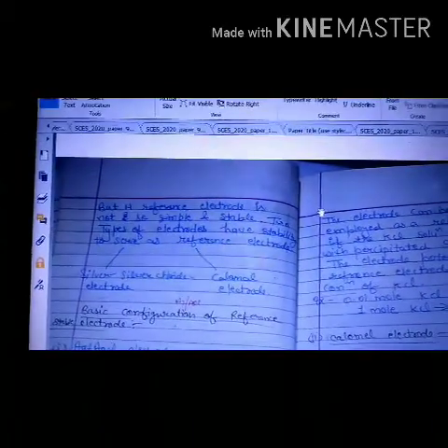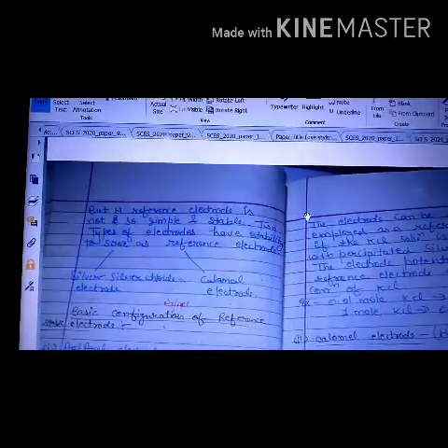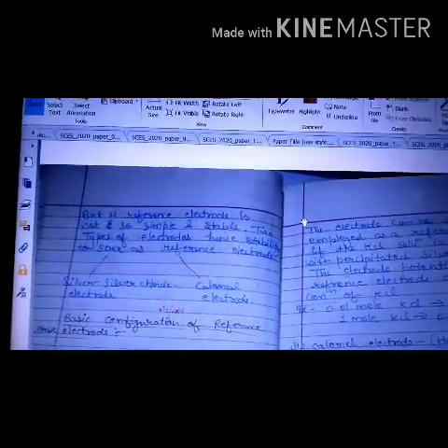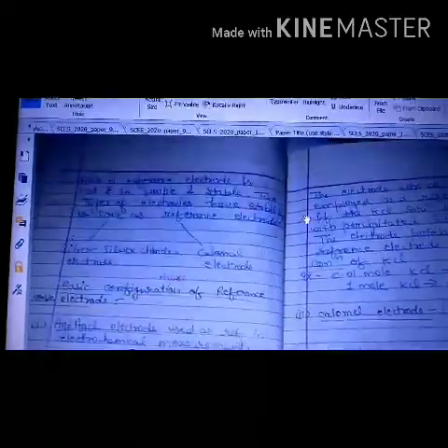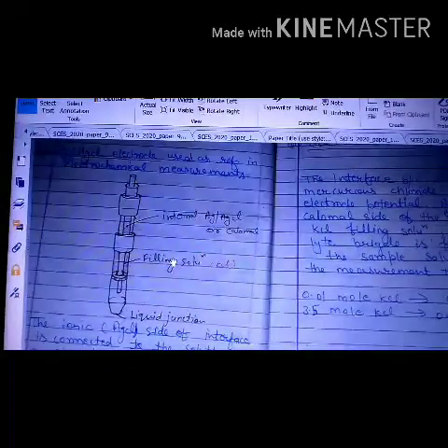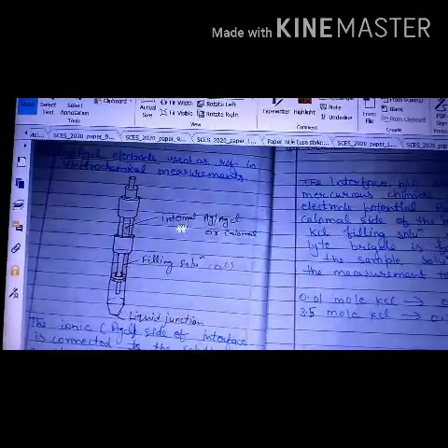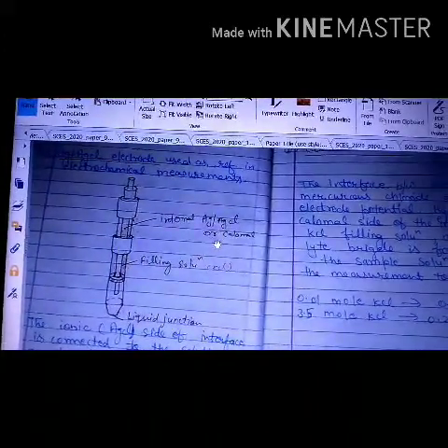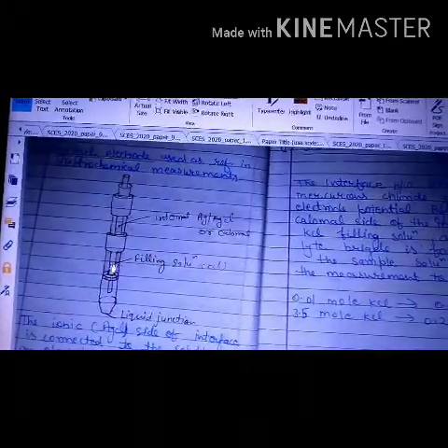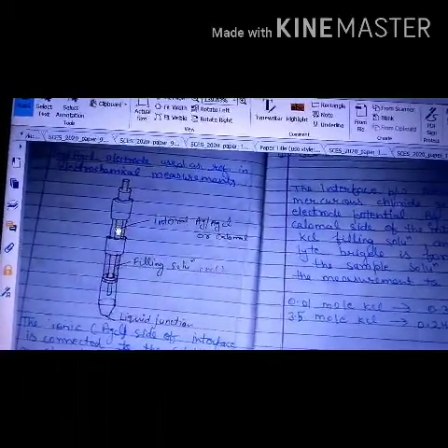So the other two types of electrodes which we use are the silver chloride electrode and the Calomel electrode. Now we are going to look at the basic configuration of a reference electrode. In this figure we can see the structure of a reference electrode, in which there is an internal AgCl wire or a Calomel wire. This is another type of material. Then there is a filling solution, normally KCl. This solution connects this electrode with the liquid junction of the human body.